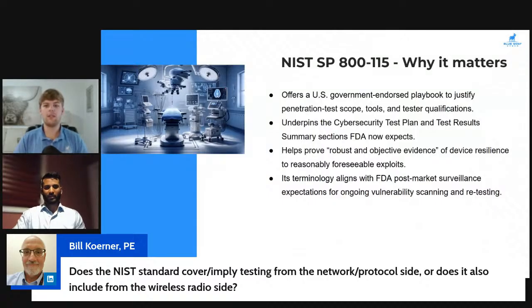Yeah, so going back even a few years, the first buzzword that came out of cybersecurity was penetration testing. Before anyone knew anything about the guidance or what to do, the first thing everyone resorted to was penetration testing, right? And I think to an extent that still remains the gold standard as an overall test, although there are some specific tests you need to run in addition, and that really feeds in as a key source of your cybersecurity risk in your risk management process.